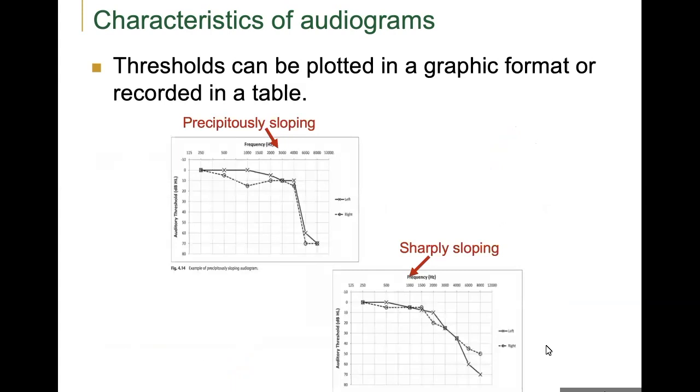So we also have different kinds of hearing loss, different characteristics of audiograms, okay? And we can make guesses about what part of a person's ear is being impacted that's causing the hearing loss. So we've got our outer, middle, and inner ear.